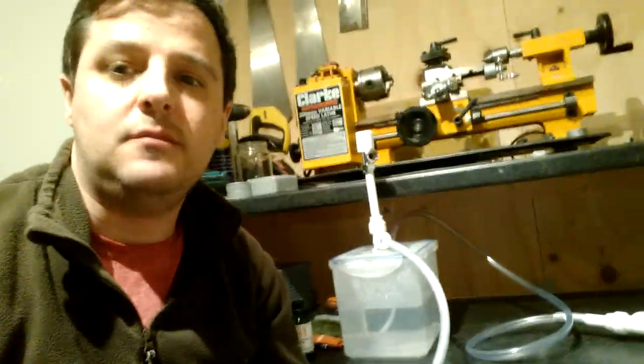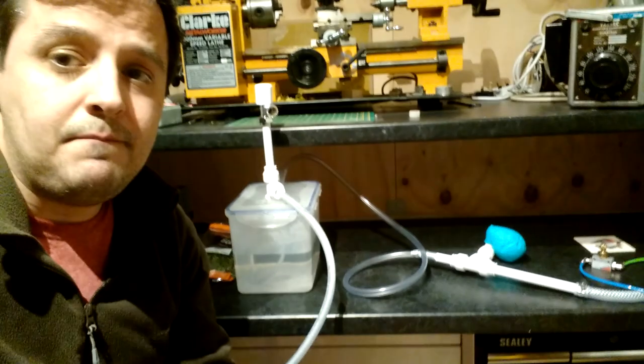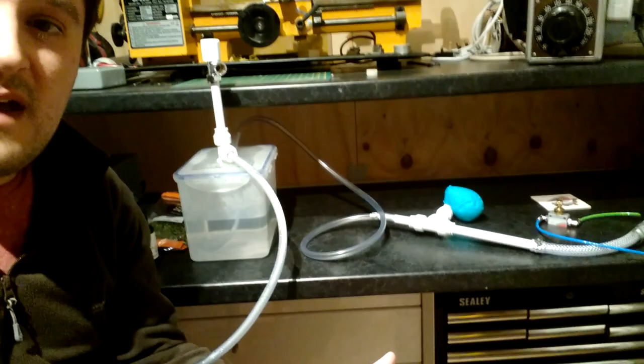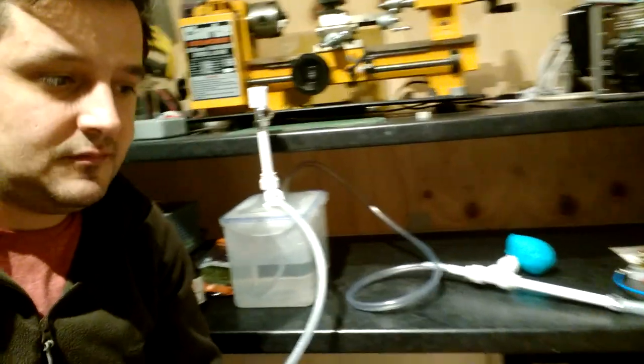And that's it. So in its simplest form, a ventilator is not a complicated device at all. It's actually extremely simple. And what I wanted to show here is that you can make one that's lung safe using a handful of components you can buy in B&Q. So yeah, good luck. Go and experiment for yourself.